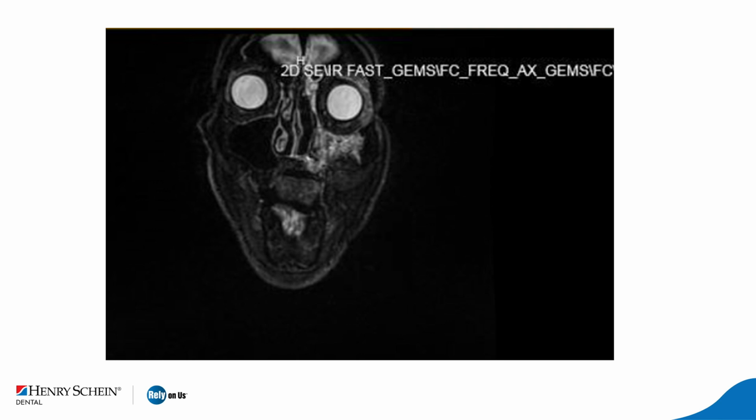And that is the MRI. So you can see that there is hyperintense signal, like we say, and you can see that the two orbits are very bright on that exam, which is a T2. So the fluid or the CSF will be bright, and you can see that there is a hyperintense signal within the left sinus, extending from the crestal area again to the floor of the left orbit. Then you can appreciate that the left orbit is also positioned inferiorly. So the floor had some erosion, so the orbit is losing its support.